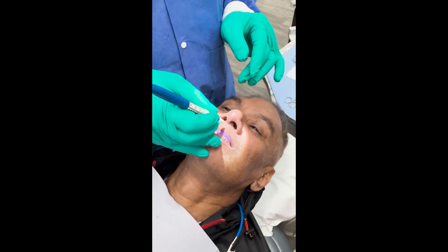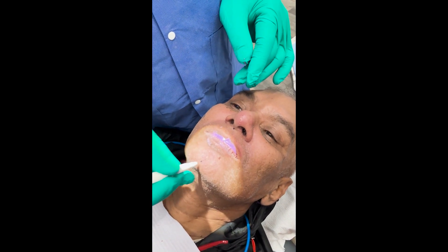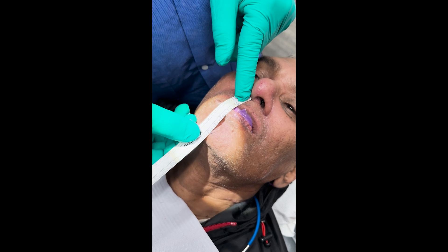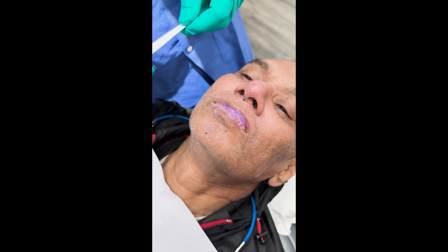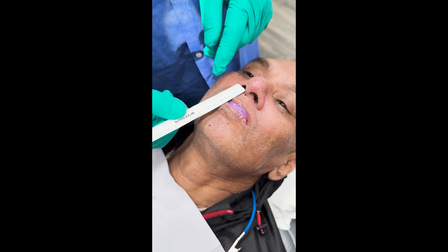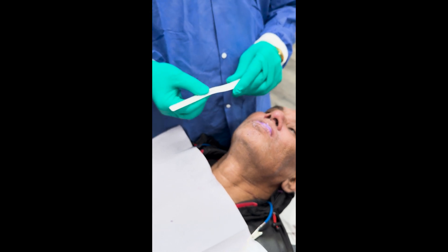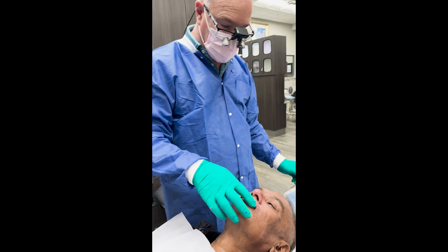I'm going to put a little mark just underneath his nose and one here at the chin point. We're going to measure where we're at — we are at about 60 millimeters from just under his nose to the tip of his chin. You can take any random point; the point is to compare this measurement to what he has with his existing dentures. If it's 65 with his existing dentures, we'll tell the lab to open the vertical 5 millimeters. If it's 70, we'll tell the lab to open 10 millimeters.